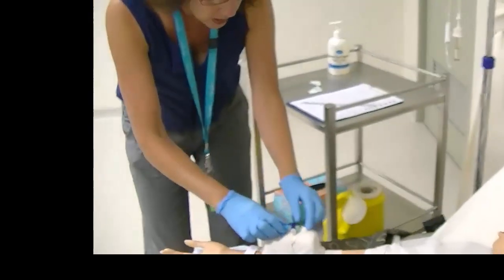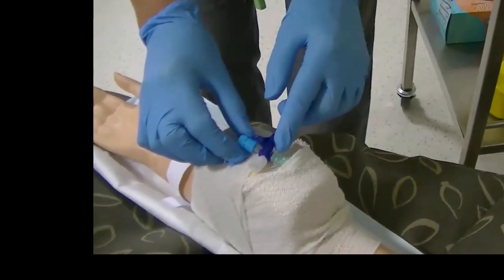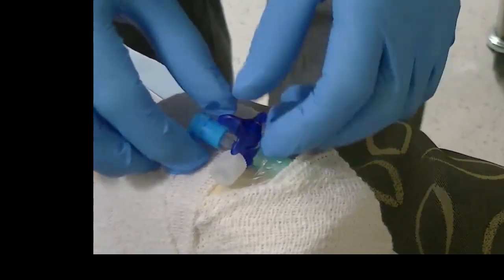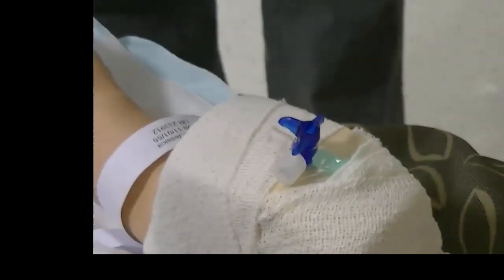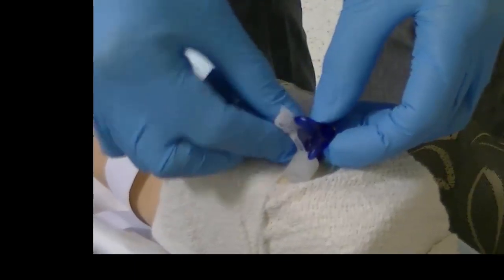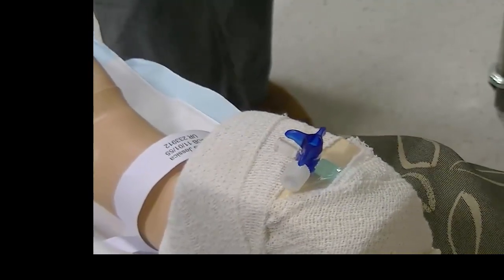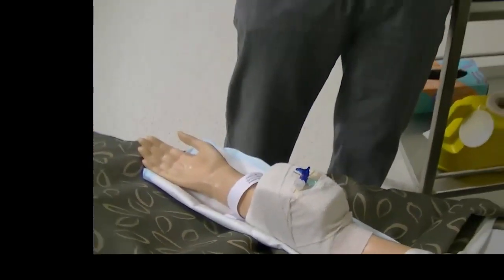Here we go. So I'll just make sure it's turned off to the patient, which means that the three-way tap, the side with no little wing to it, is off, so it's off to the cannula. And I'll unscrew the cap. I would replace that with a new cap when I'm finished. Give it a good swab and allow 30 seconds for it to dry. Great. Whilst it's drying, I'll just get my line ready.